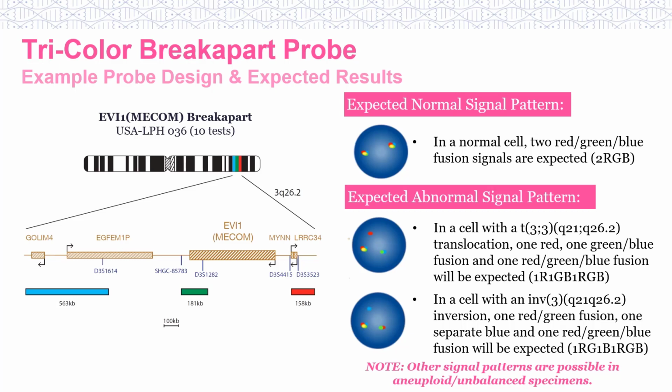Inversion breakpoints are found centromeric to and include the MECOM gene, covering about 600 kilobase, while the majority of breakpoints in 3q26.2 translocations are telomeric to the MECOM gene and cover a region including the telomeric end of the MDS1 gene and the MYNN gene. An aberrant expression of the MECOM gene has an unfavourable prognosis and, potentially, a very aggressive clinical course.